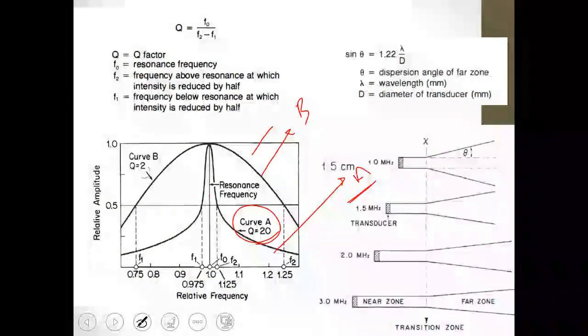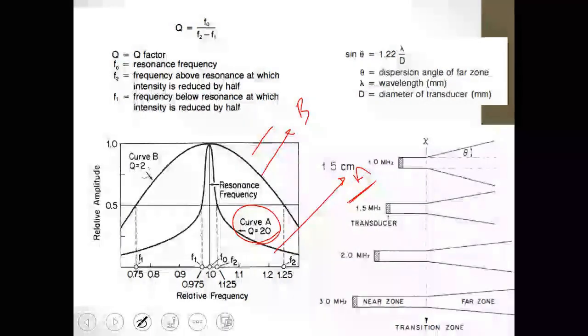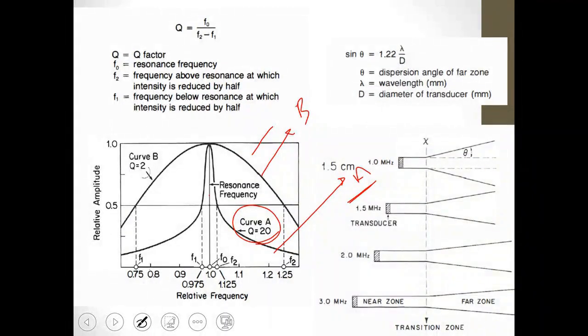All right? There is an object behind it. You send a pulse, then another pulse behind it, and another pulse behind that, and so on. You are increasing the pulse rate frequency. So, what does this fast frequency help with? I might not explain it to you right now, but I will explain it to you later, God willing. It helps you to differentiate between what is inside, and this makes things appear more clearly with high frequency, right?